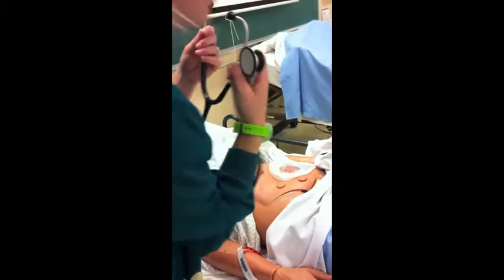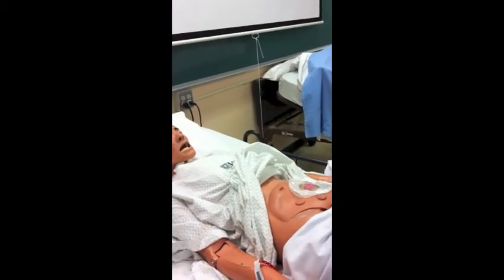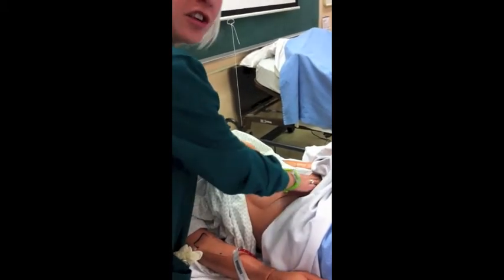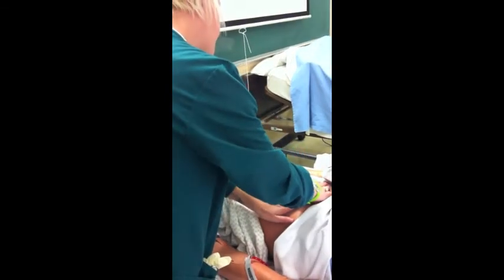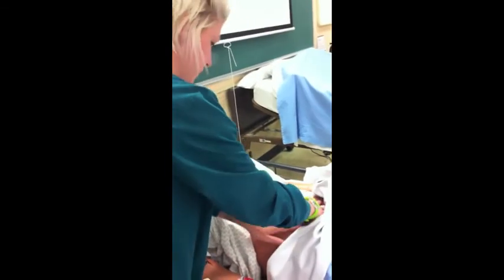I listened to all 4 quadrants. She's positive times 4 for bowel sounds. I'm now going to palpate her abdomen to make sure it's soft, and make sure that there's no distension, no hardness. I'm going to feel for her bladder, make sure there's no distension.